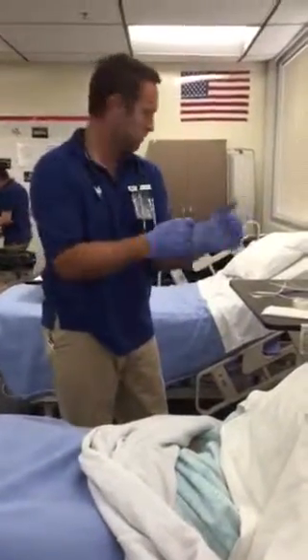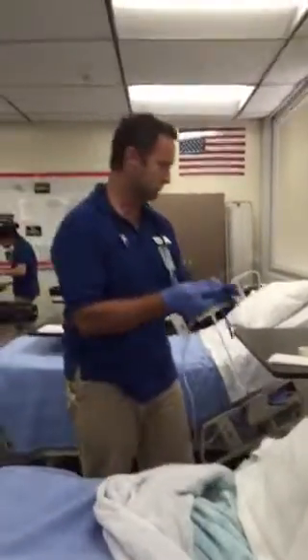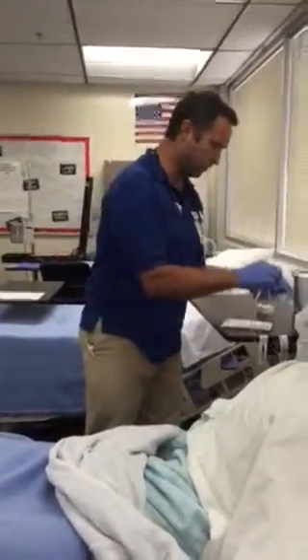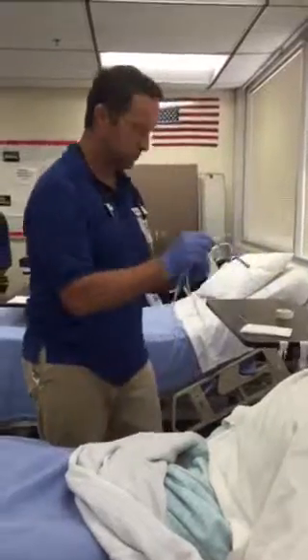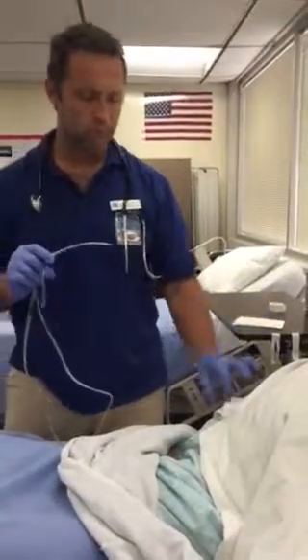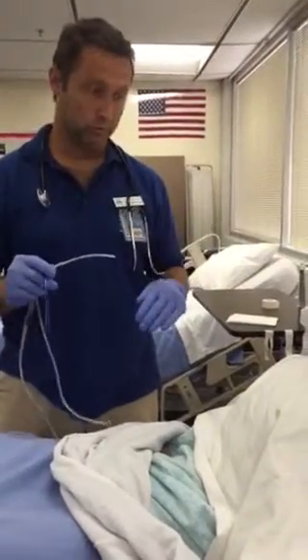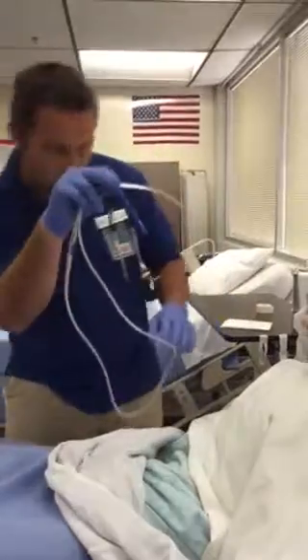I'm going to take the NG tube, insertion tube. I'm going to lubricate about 4 or 5 inches at the tip, just to help it go down. So there we go. All right, now I've explained to him what we're going to do, and he's had this process before. He didn't like it, but that's why he's familiar with it. So, here we go.